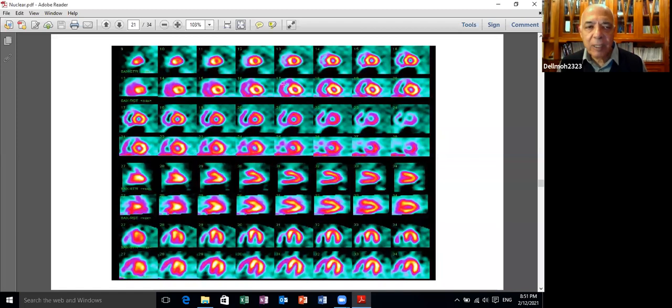But the important thing here is the right ventricle. This is a resting image. So the right ventricle shows up. I showed you a slide which shows that the right ventricle brightens up and appears during the exercise and or during stress. And we said that was because of the global ischemia of the left ventricle.